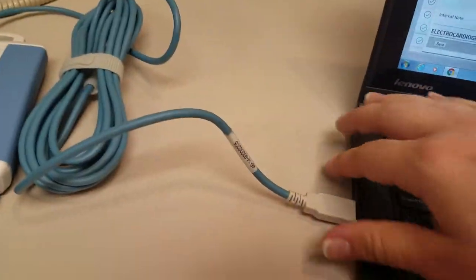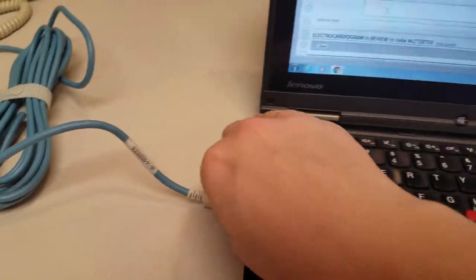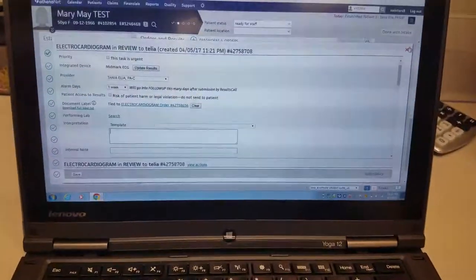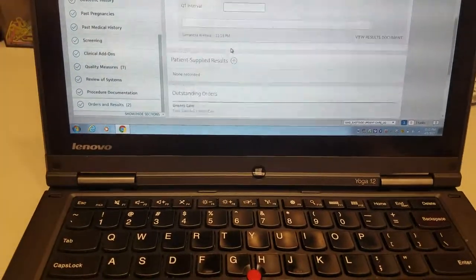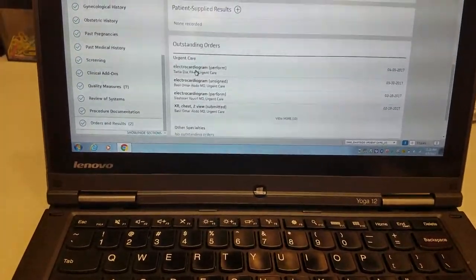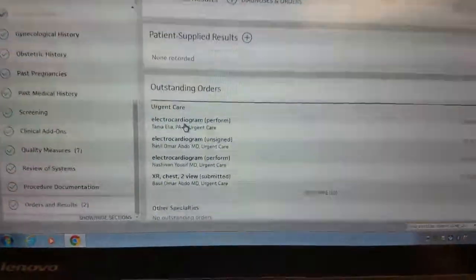Again, it just hooks up through the USB and you work on it right within the orders and outstanding order section of Athena.